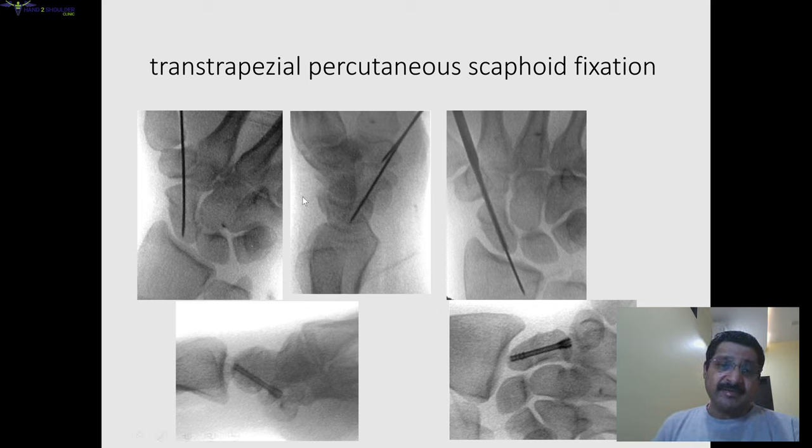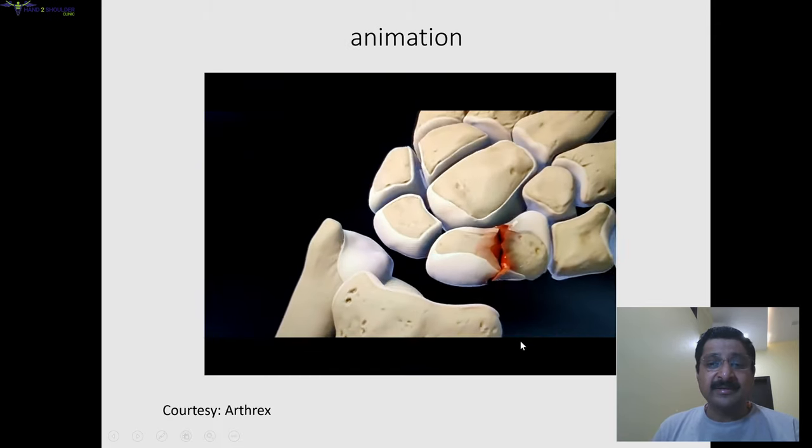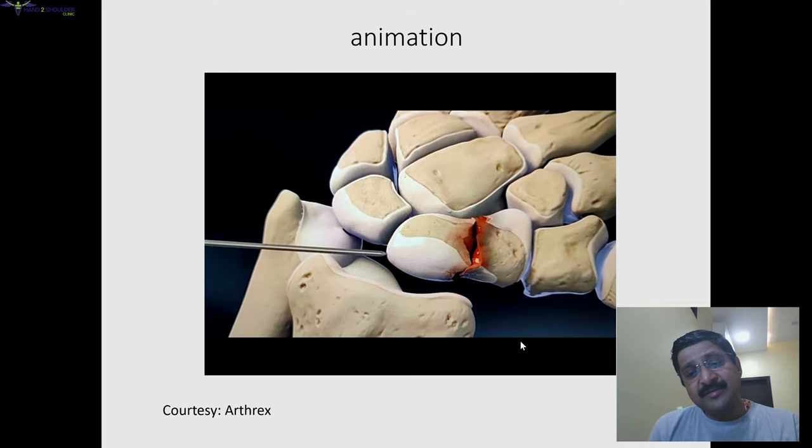Another volar approach is going through the trapezium — the transtrapezial approach. As you can see, the position of the screw is more central, so biomechanically it is more advantageous. The only thing is you have to drill through the trapezium, but your screw should remain only in the scaphoid, so you pass the screw through the trapezium into the scaphoid — the length must be accurate so it is not protruding out.